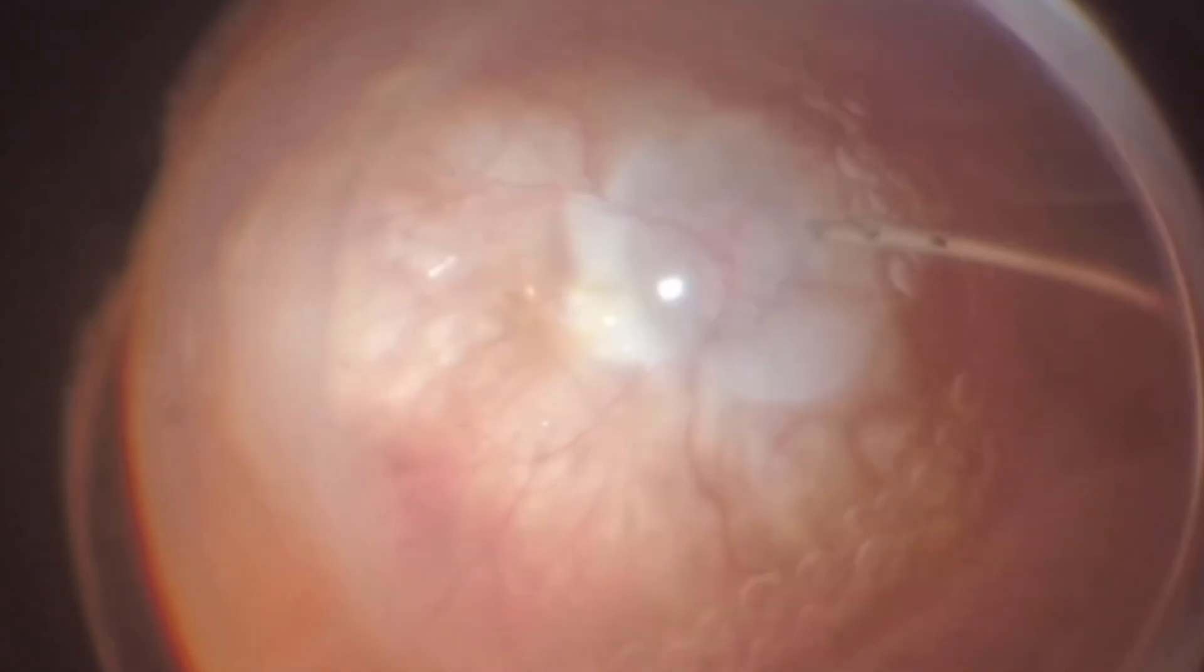Injecting perfluor against increased IOP raises the chance of forming multiple bubbles, known as fish eggs. The optic disc must always be monitored during the injection, and if the central retinal artery shows signs of closure or pulsation, the pressure applied during the injection should be reduced.